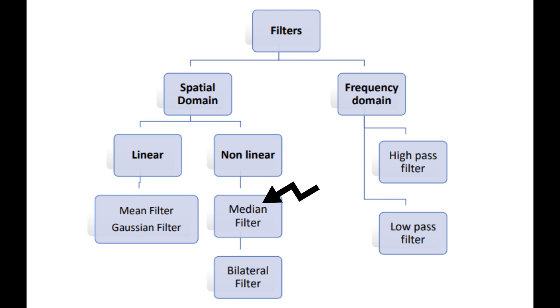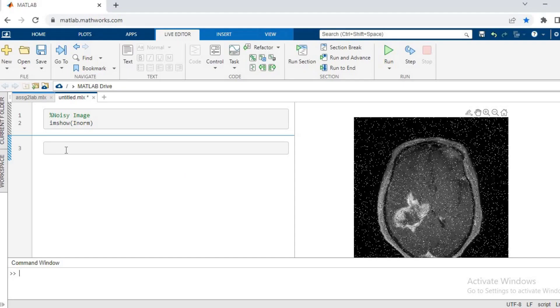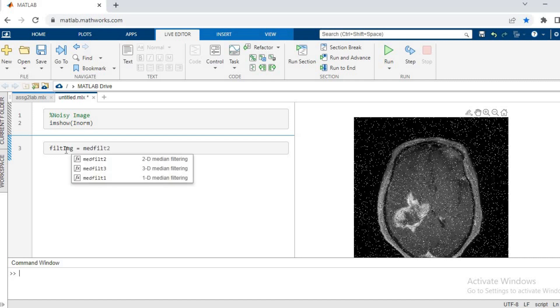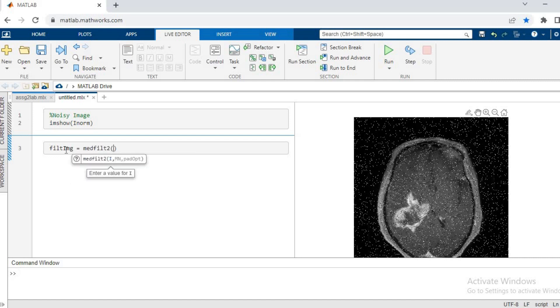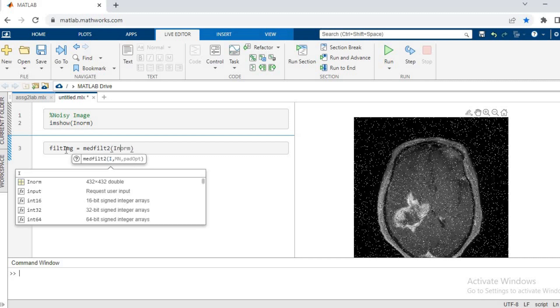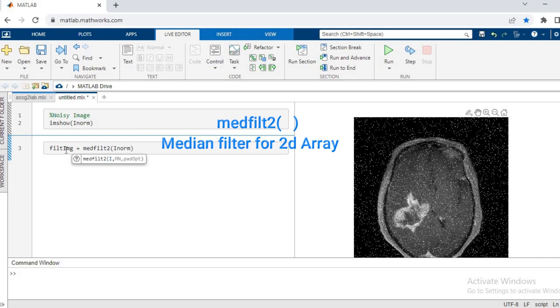Let's see. We'll write filled image equals median filter bracket I norm. So I norm is the image on which we want to apply the median filter, and the 2 is for 2D arrays or 2D images.